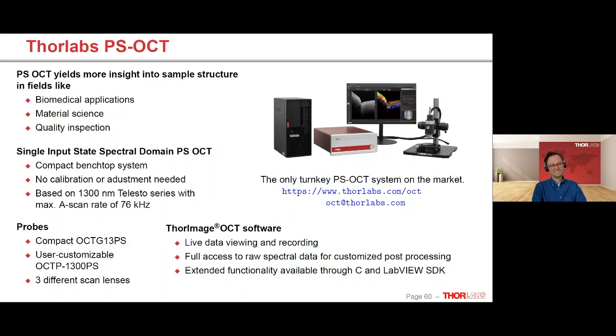Pablo? So I think that we don't have the resolution to distinguish small effects at that scale, but the objects that are generating that birefringence are actually macromolecules in the nanoscale.